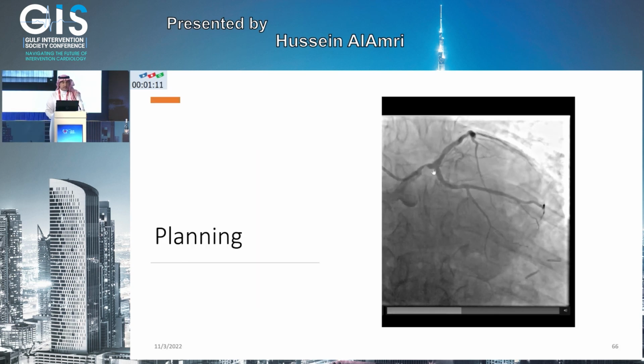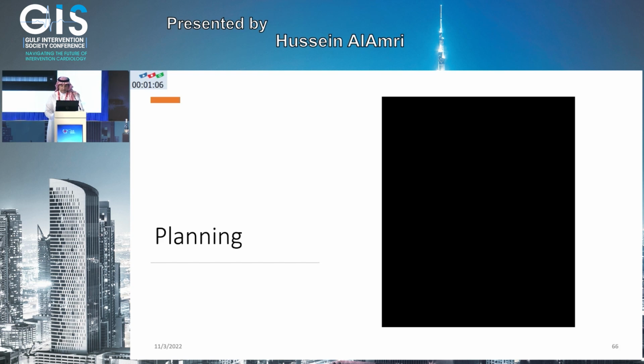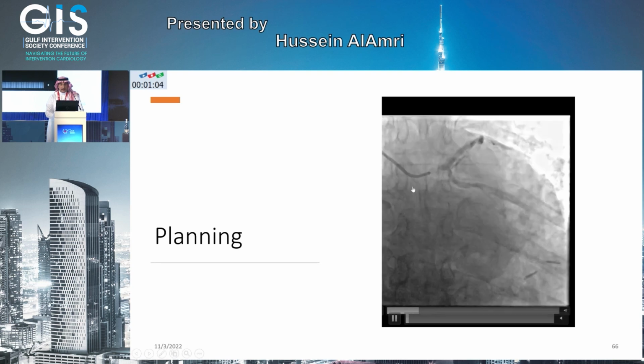Kissing inflation does not mean that you have to stent the lesion. Again, the initial decision and planning is important.